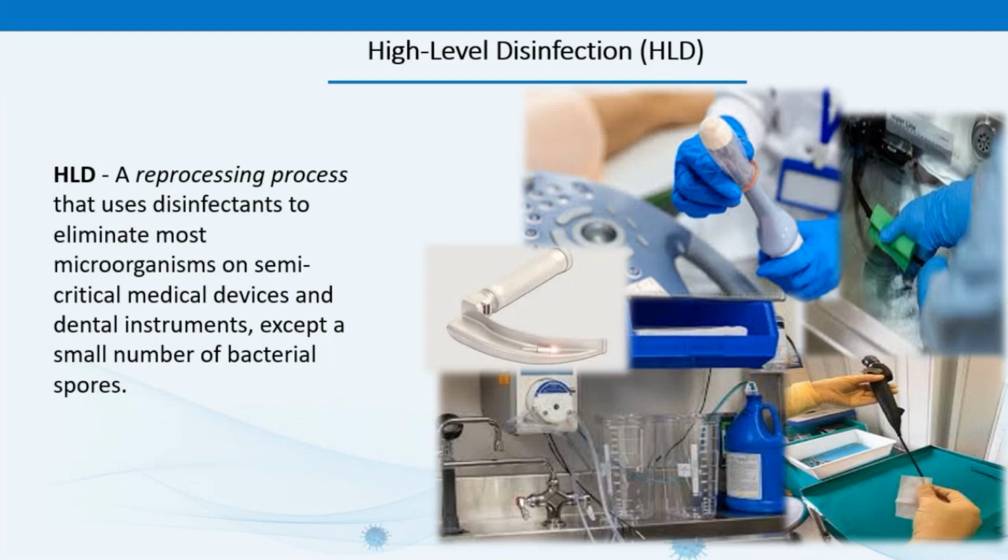Why is high-level disinfection needed? Well, it's used for reprocessing semi-critical medical devices and dental instruments that are heat-sensitive or incompatible with traditional sterilization methods. And where is HLD performed? ERs, ORs, OBGYN clinics, endoscopy, bronchoscopy, and GI clinics, interventional radiology, central sterile processing, SPD, ambulatory and office-based surgery facilities, and decentralized locations throughout healthcare facilities.